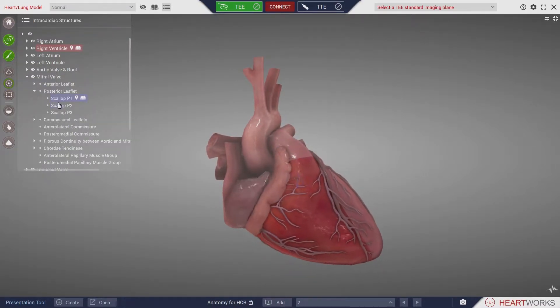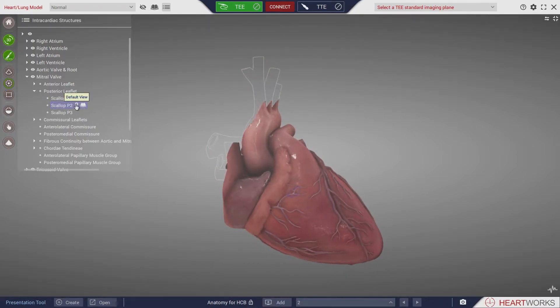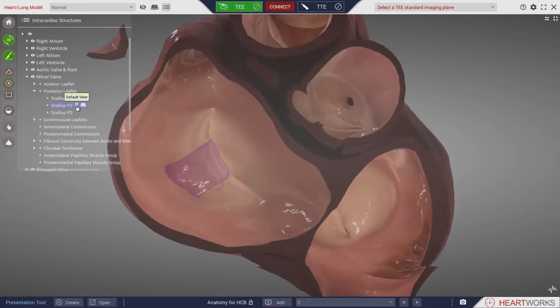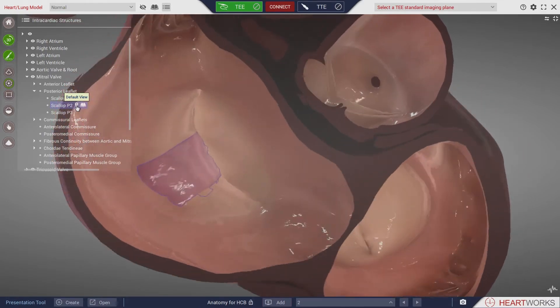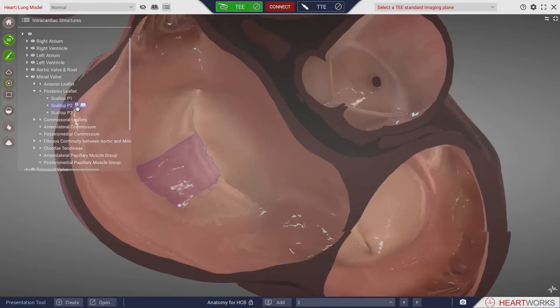Structures may be selected from the model or from within the structure list. Clicking the default view icon will display the selected structure within the heart.